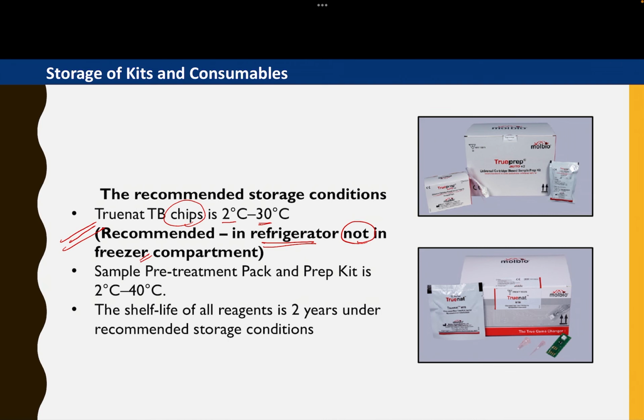All other things like the buffer and the pre-treatment pack, you can keep at room temperature, preferably away from sunlight, below your shelf or in a cupboard. You can keep these things and they have a good shelf life of 2 years.